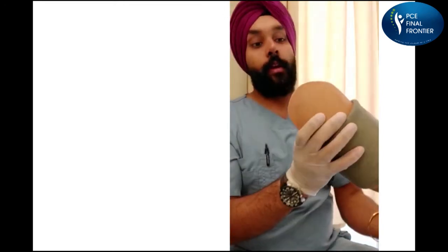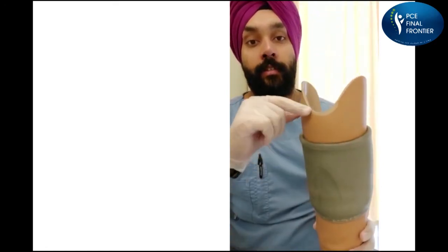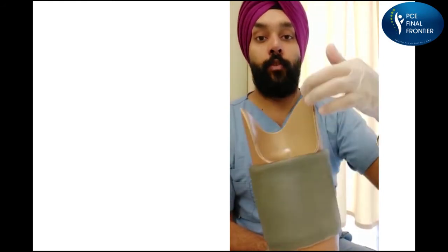Let me show you inside the socket. Okay, you see that little hole in there, right? Now you see the shape of the socket. How do you know which side is front and which side is back? Obviously with the foot, but you can see there's a rest place for the patella to fit here, right? And this space is for your calf muscle to rest.